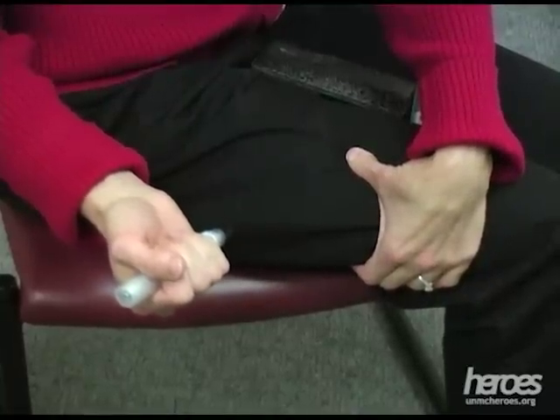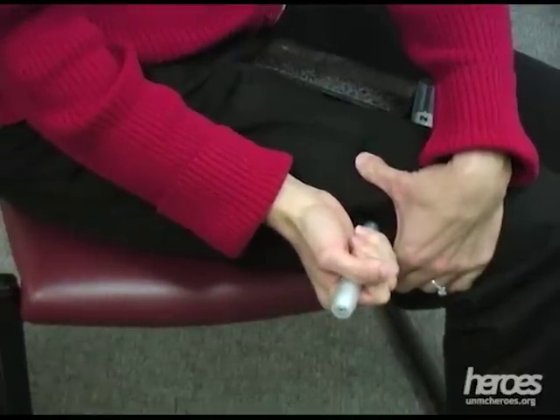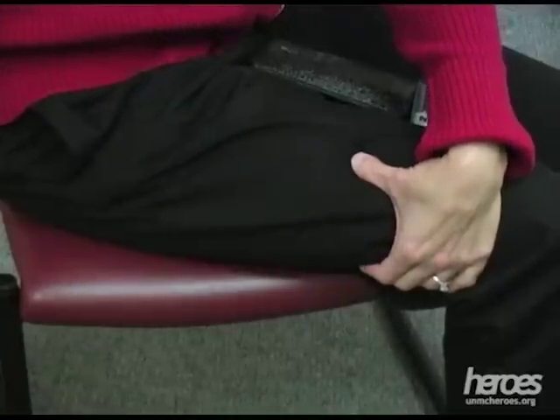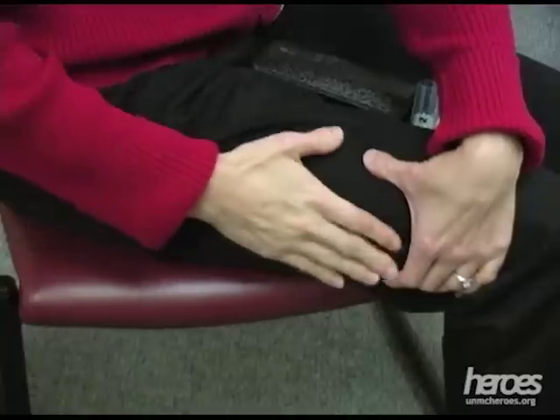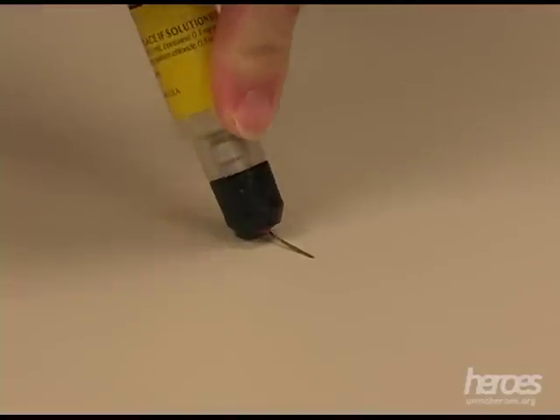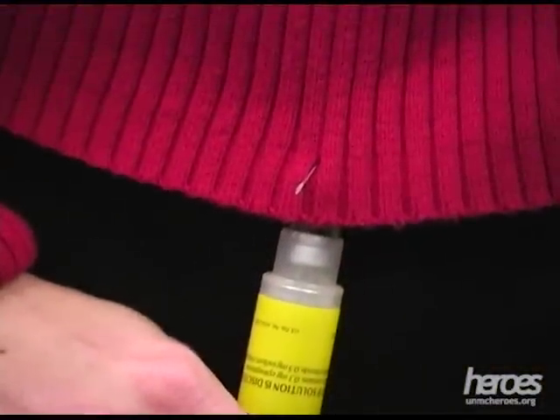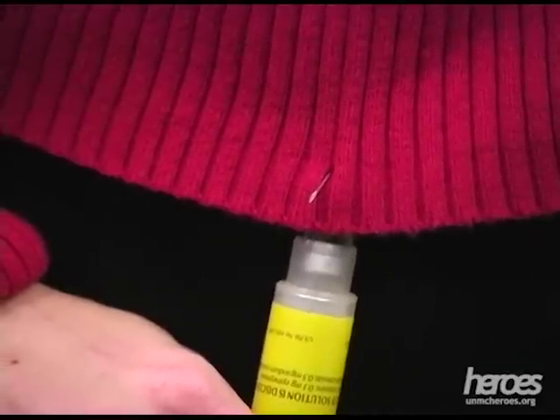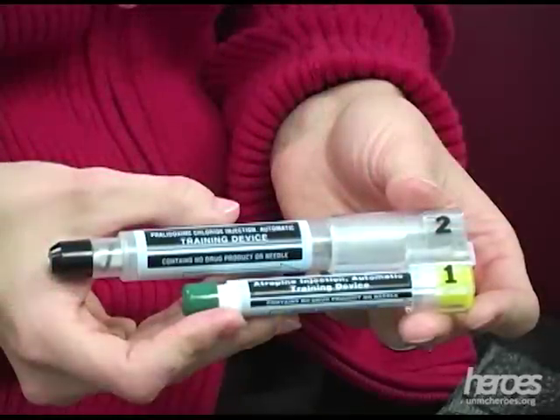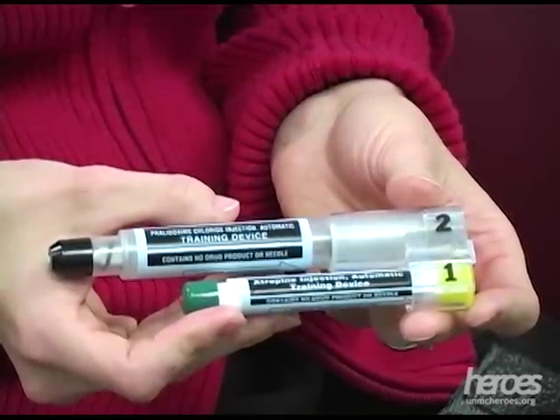There should be plenty of tissue for 6 injections should the need arise. After use, it is suggested in the package insert to bend the needles against a hard surface toward the auto-injector and pin the injectors to the victim's clothing. This helps rescuers to know how much antidote has been given. Move out of the contaminated area right away and try to find medical help for yourself or the victim.